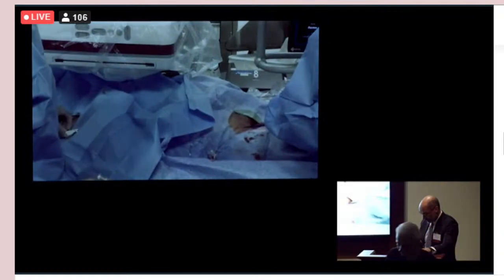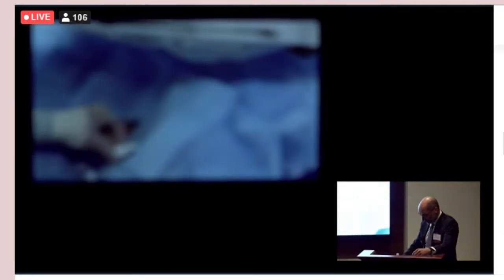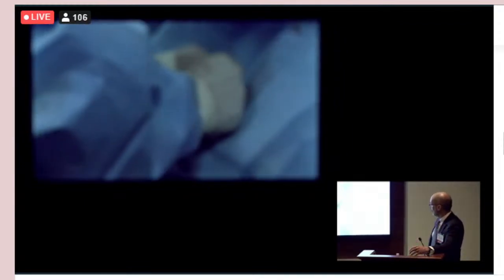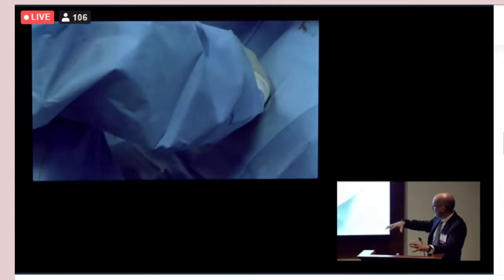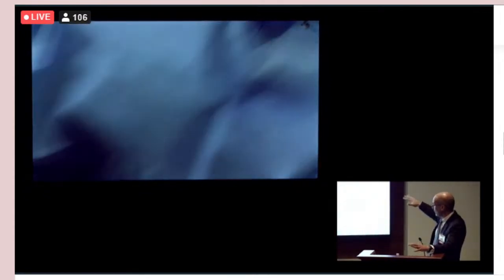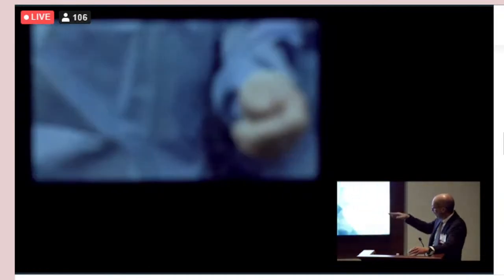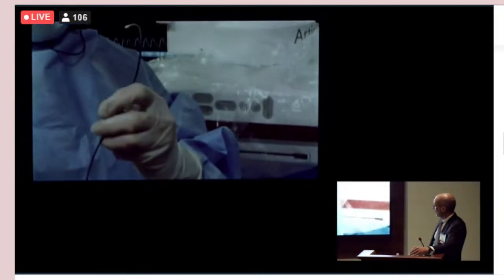And once we have the coronary sinus engaged, I like to bend the sheath towards me because I'm also working at the groin. So instead of having another Mayo stand or a table next to the neck, I work all on the right side of the patient in the same working space. This is, of course, after you have CS engagement with the sheath.